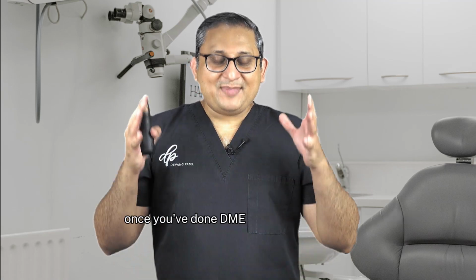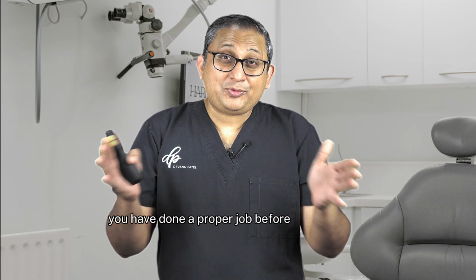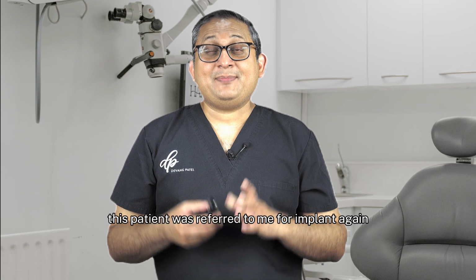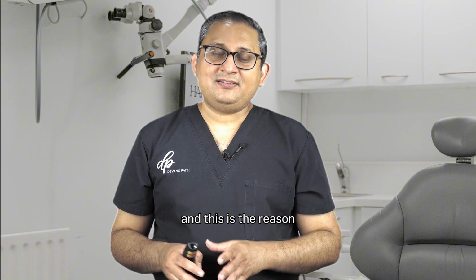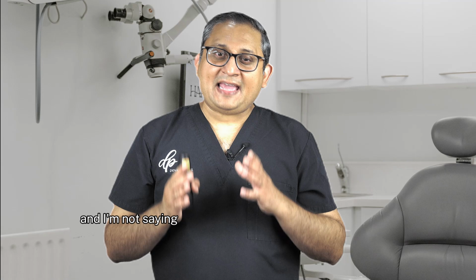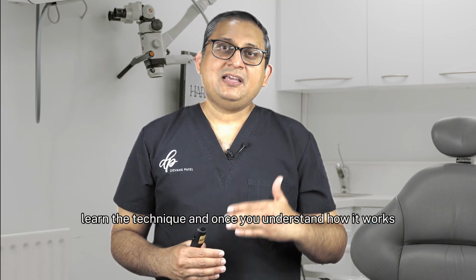Once you've done DME, make sure that you take post-operative radiograph in order to make sure that you have done a proper job before proceeding to any indirect restoration. And you can see here, this patient was referred to me for implant again, but because of the medical condition, could not have an implant. And this is the reason we did an onlay for this patient. And this is a case 7 years after I've done the onlay. And I'm not saying every single case you should attempt this, but once you learn the technique and once you understand how it works, you can push the boundaries.